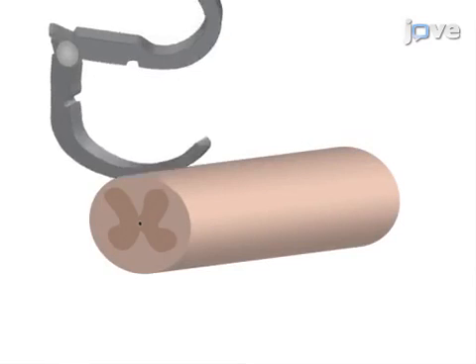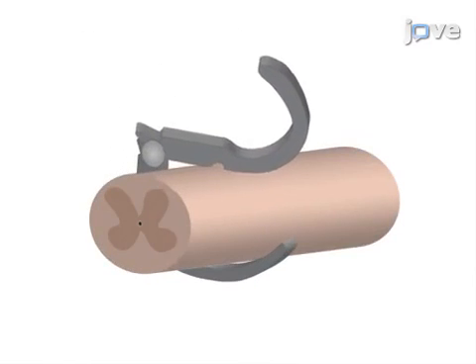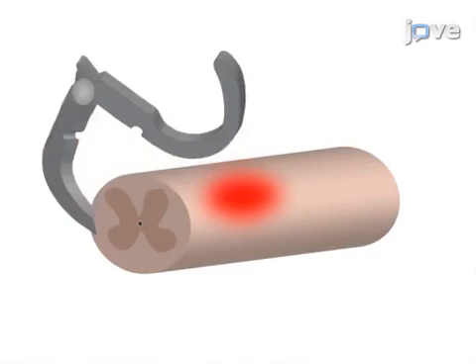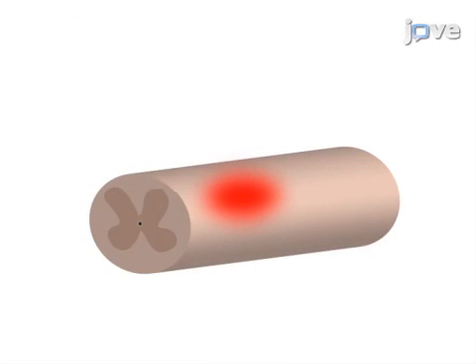First, an aneurysm clip is placed around the spinal cord and kept in place for 1 minute. This results in a bilateral contusion compression injury. Next, SAPs are injected at the injury epicenter. NPCs are injected immediately following SAP injection. An osmotic pump with a subdural catheter is inserted for the sustained delivery of growth factors.